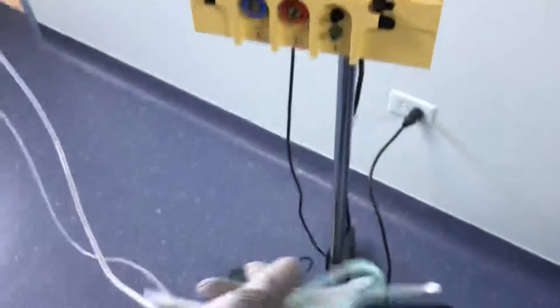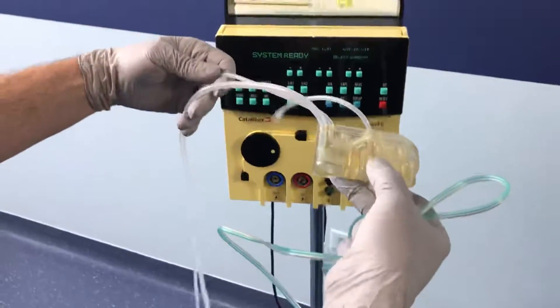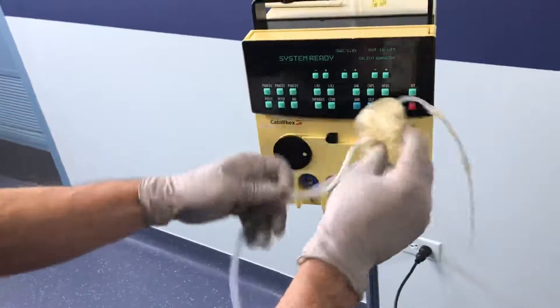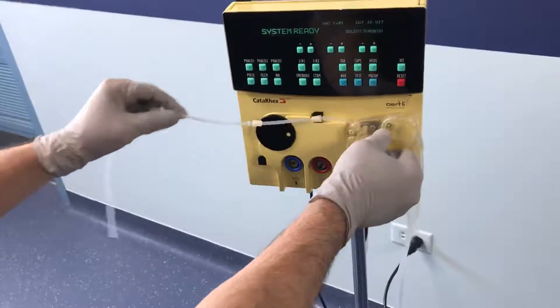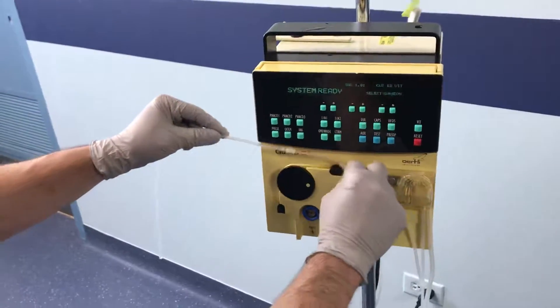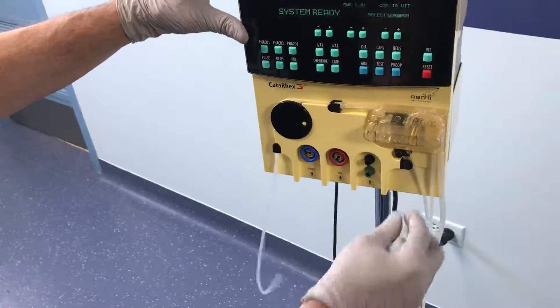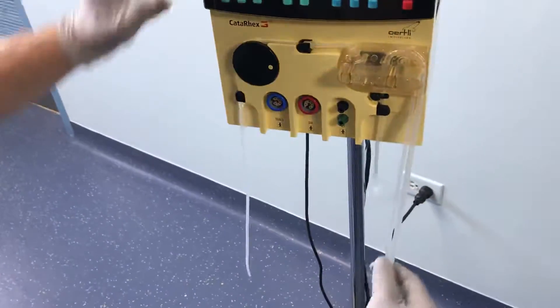There are two things that we need to do the vitrectomy. One of them is sterilizable — it can be heat sterilized. It comes in here, that goes in that little hole there. Put it in that little hole and then clamp it down until it snaps. This comes in this side of the black, then you've got to stretch it to go around and come in the bottom. This here has to be snapped down underneath.